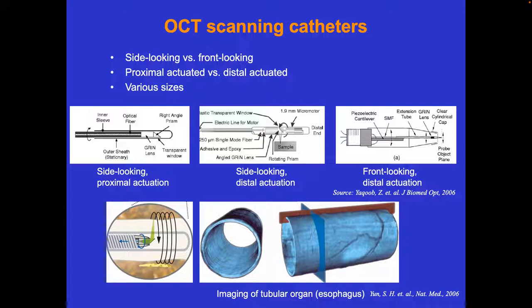The problem is that building detectors and spectrometers at 1300 nanometers is difficult, because the devices that you use for that, indium gallium arsenide, are not CMOS anymore. They are noisier, it's harder to make them at certain performance specs and make them big, and it didn't really exist because it's far in infrared. And so why would you develop a sensor for that when everybody wants a sensor for their camera? That's visible. So that's why there was that push towards the swept laser concept for 1300 nanometers. That's now the dominant implementation for endoscopy.